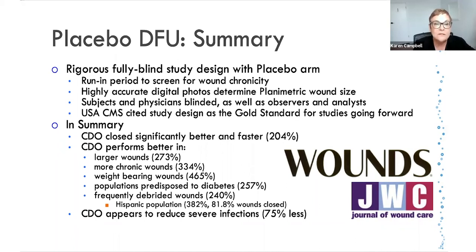There was a run-in period to screen for wound chronicity, and I believe that is very important in this study, because in the run-in period, with debridement, with moist wound healing, with offloading, if the participants' wounds were healing really, really quickly, they were not included in the study. Only wounds that were not healing at the rate that you would expect were included in the study. We had highly accurate digital photos, and we had planimetry to determine wound size. The US CMS cited this study design as the gold standard for studies going forward.